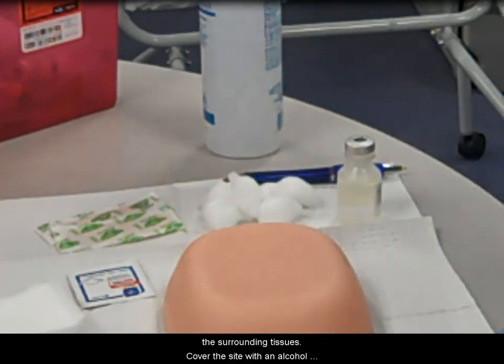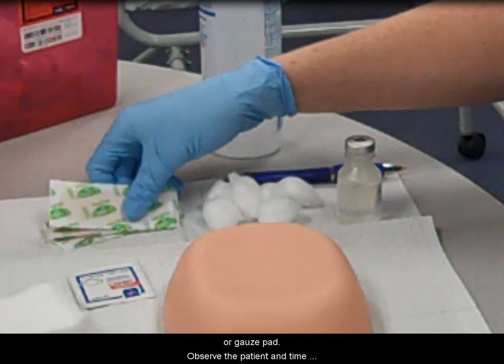Cover the site with an alcohol or gauze pad. Observe the patient and time the reaction if warranted. Give the patient instructions as ordered and answer any questions. Apply a bandage.